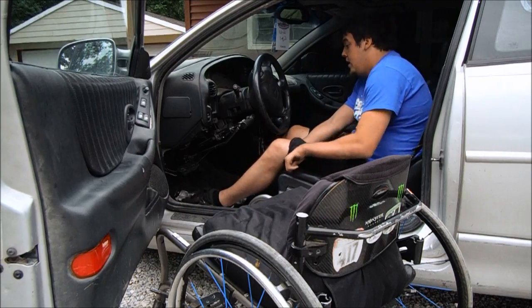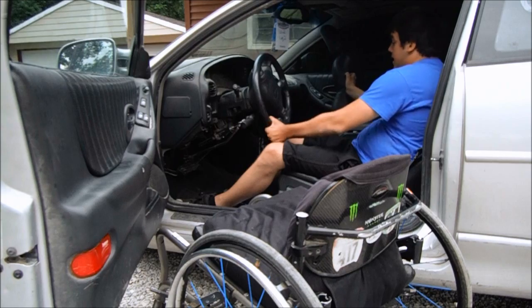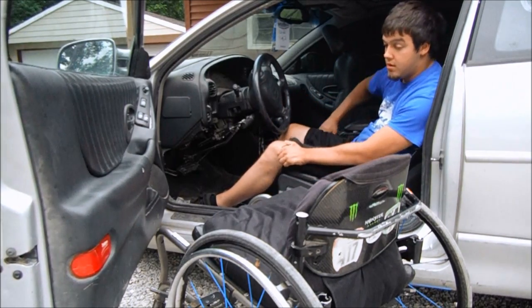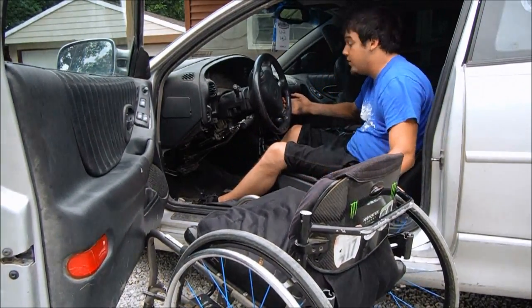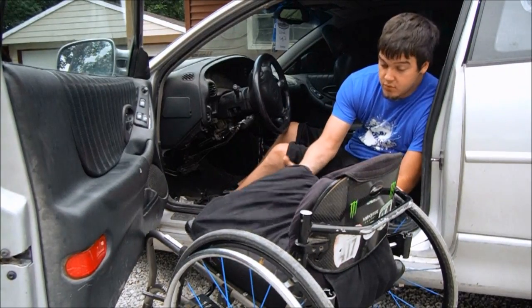I get adjusted in my seat, and I keep my driver's seat leaned back — I don't drive with it leaned back like that, so it gives me the room I need to take my chair, disassemble my chair, and get it through. I'll push the passenger seat all the way forward and start disassembling my chair.